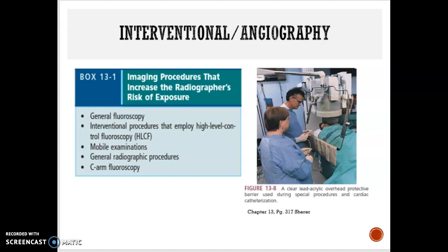The patient is always the largest source of scatter, so they should try to avoid this scatter and operate the equipment with the tube under the patient. If the tube is horizontal, they should stand on the side of the image receptor. All personnel should not only be wearing protective clothing, but also their personal dosimeters, and if they have two of them, they should be wearing one underneath the apron and one above the apron at the collar level. If protective glasses are available, they must be worn.